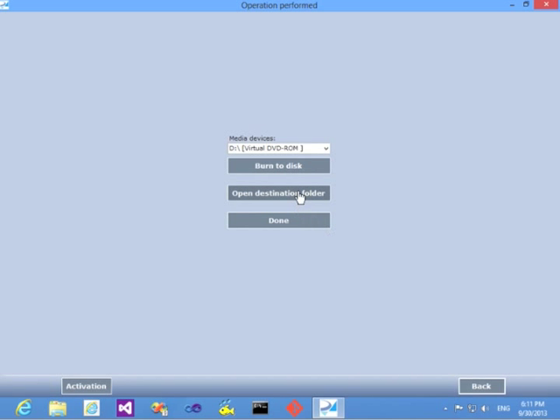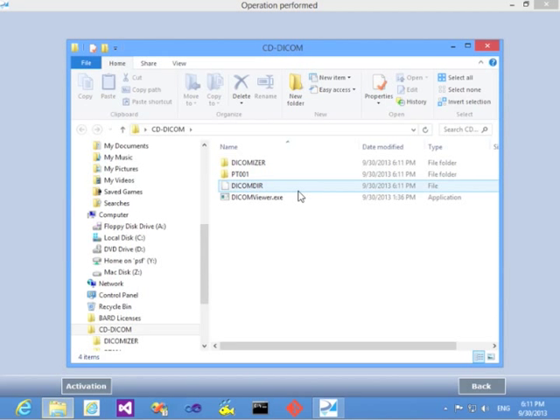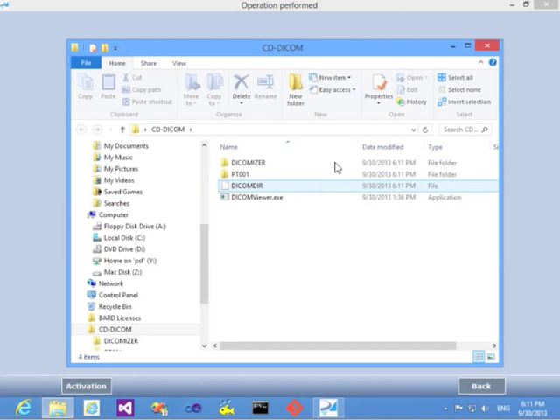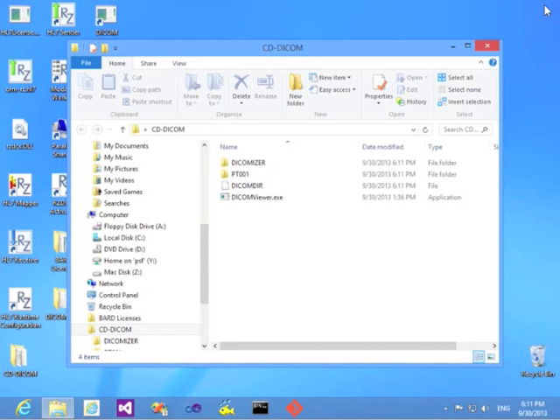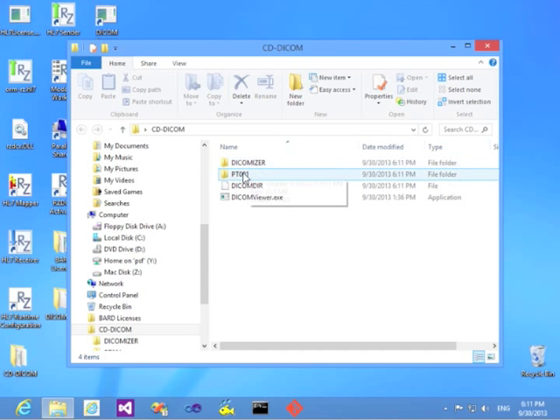Now this folder is ready and I can open it. Here it is. I'll close this Dicomizer.